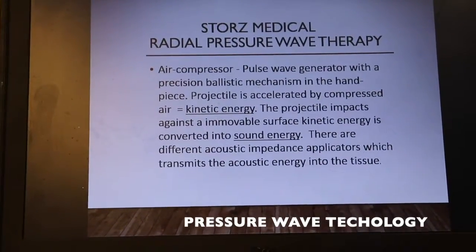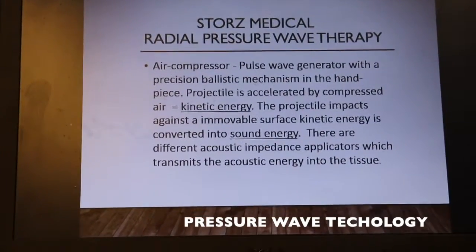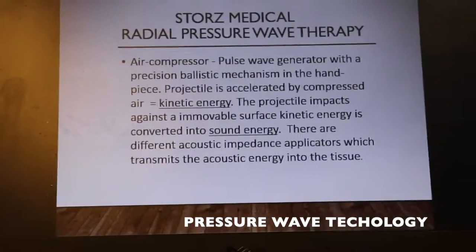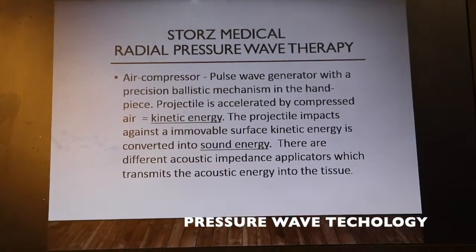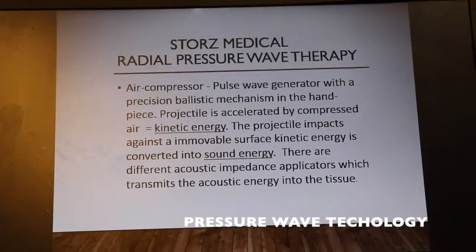Again, a precision ballistic mechanism in the handpiece, because this projectile, which is accelerated by the compressed air, converts to kinetic energy. The projectile impacts against this immovable surface. The kinetic energy is then converted into sound energy. There are different acoustic impedance applicators which transmit the acoustic energy into the tissue, which we're going to look at in a minute.